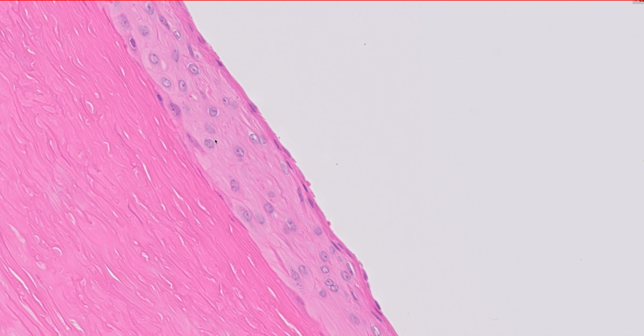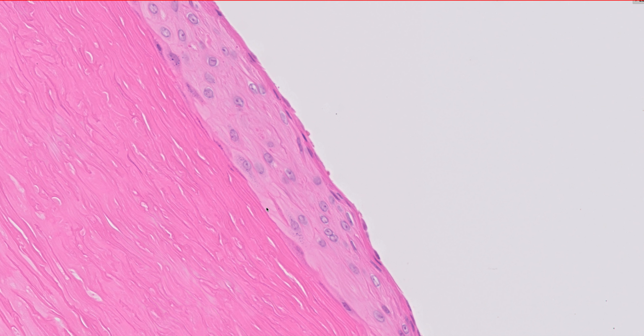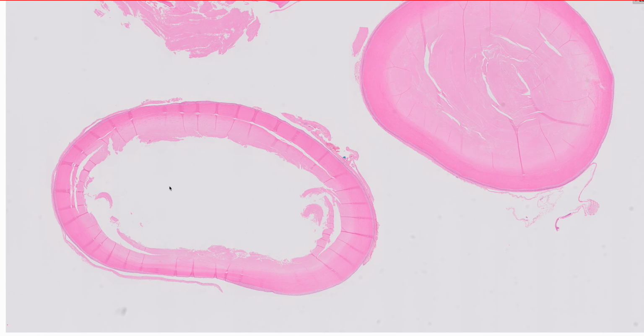And if we take a closer look at the lining of the cyst, this is what we expect to see lining a pilar cyst. So benign, bland-looking squamous epithelium showing pilar features. So it's very abundant, very pale staining pink cytoplasm. And typically the keratinization occurs very abruptly between the squamous epithelium and the keratin filling the cyst, as we can see here. So fairly typical of a pilar cyst.